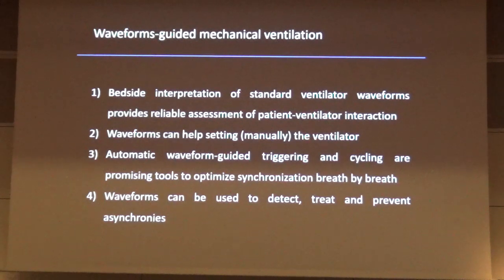So to conclude, ventilator waveforms can be used by physicians to reliably detect asynchronies and optimize the ventilator settings in difficult cases, and to prevent asynchronies, probably some automation is needed.